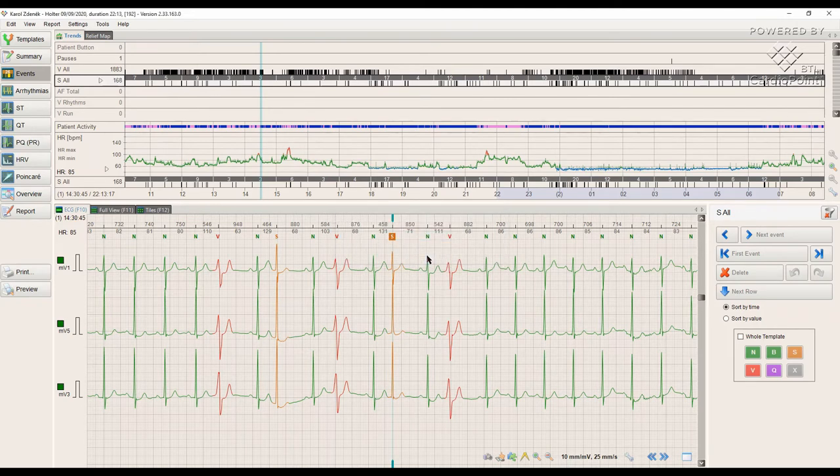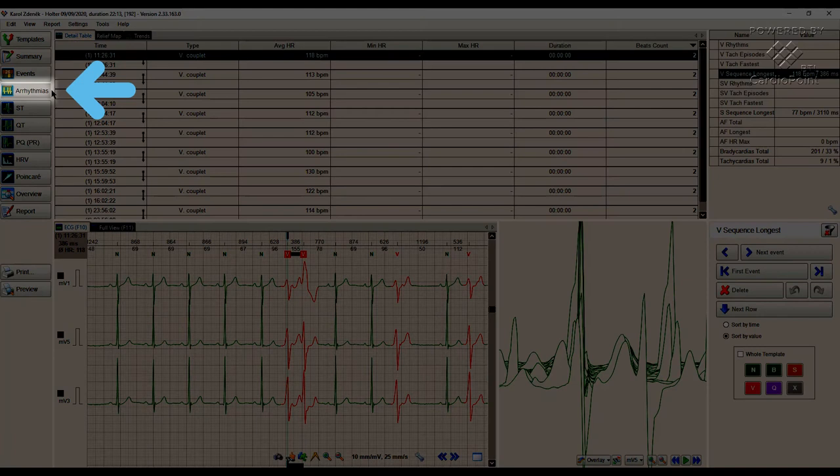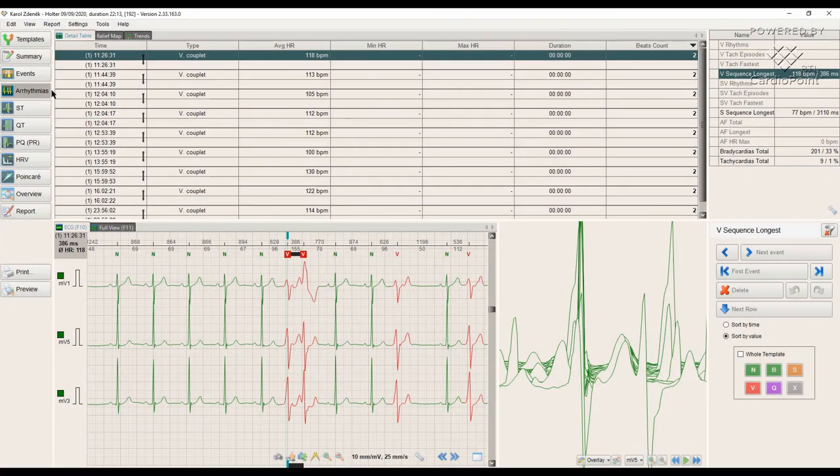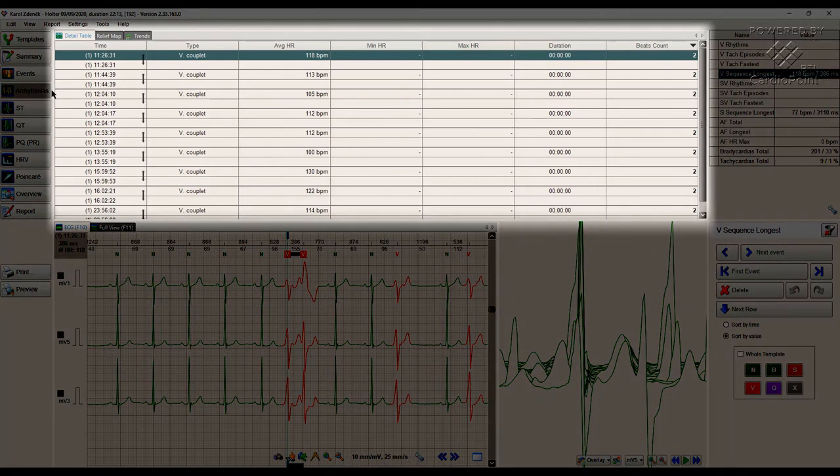Now going to the next module, Arrhythmias. This module provides the analysis of all the detected rhythm disturbances in the recording. We can see it in the detail table.